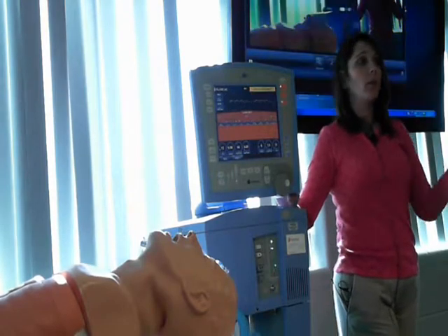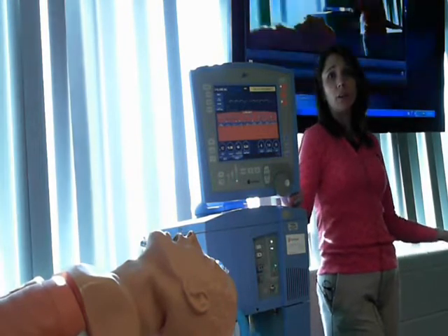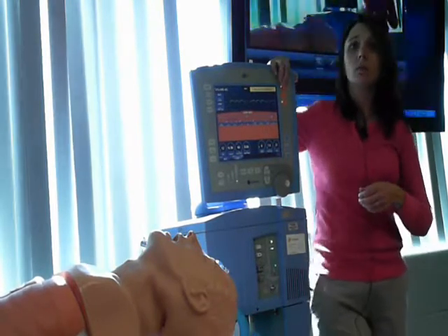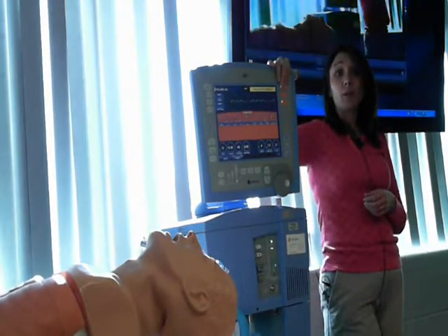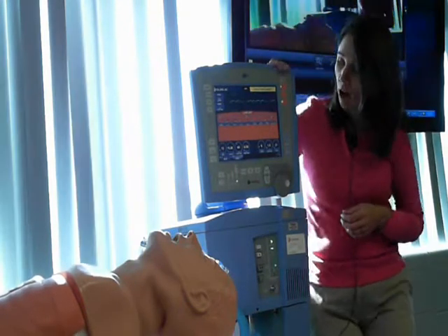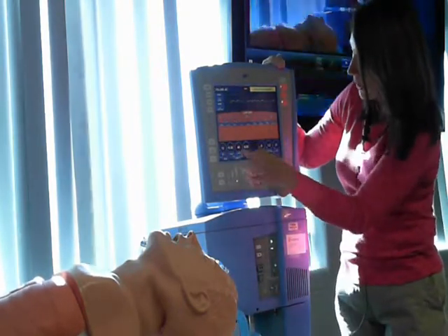Who can tell me why we can take the breath rate down on a ventilator when somebody's disease process is resolving? Because they're breathing on their own. They are breathing on their own, and we want them to have that work, okay? All right, so that's tidal volume, that's rate.